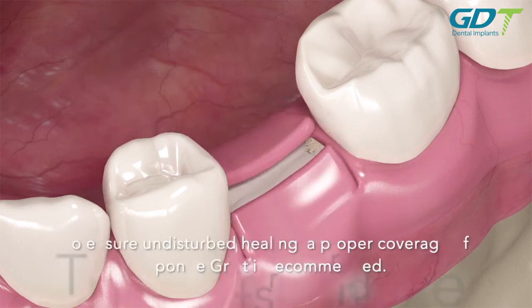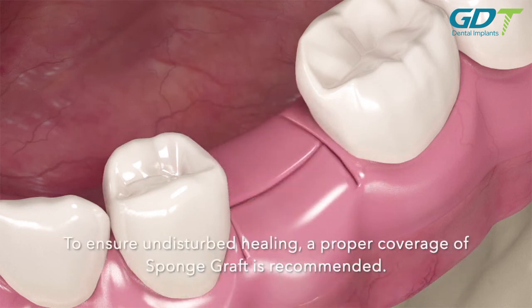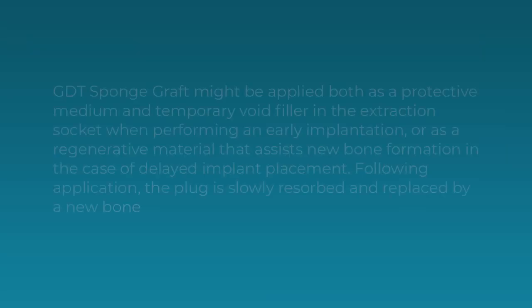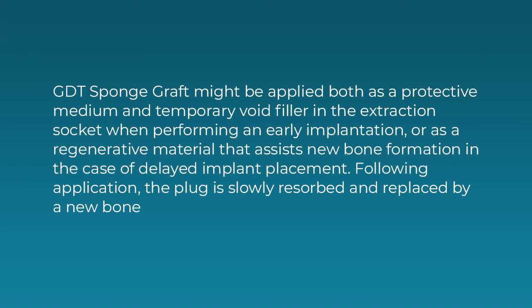To ensure undisturbed healing, proper coverage of sponge graft is recommended. Sponge graft may be applied both as a protective medium and temporary void filler in the extraction socket when performing an early implantation.